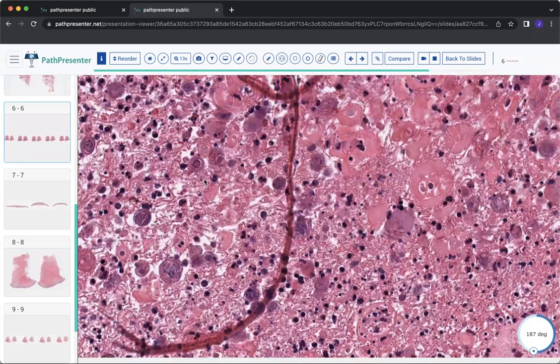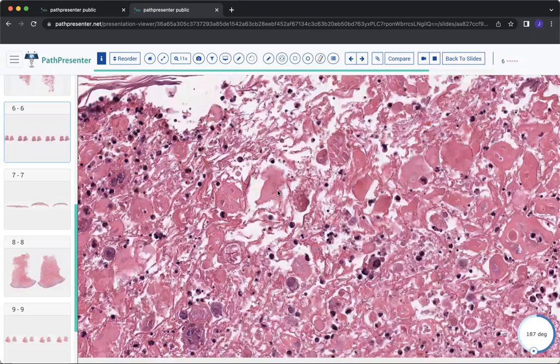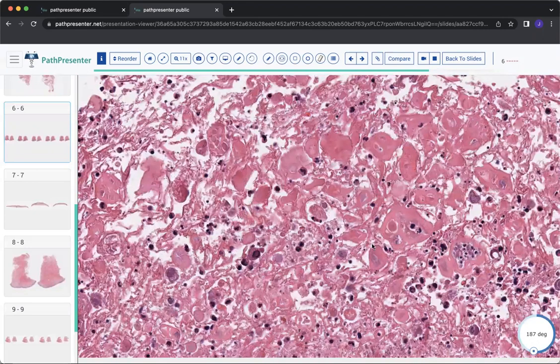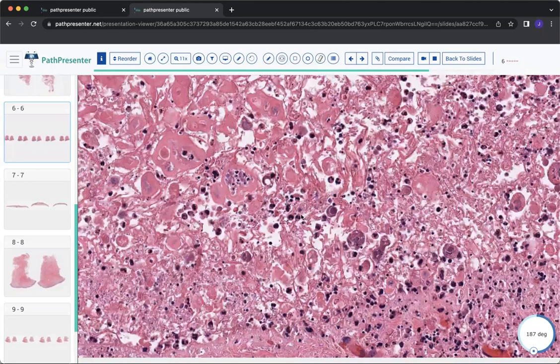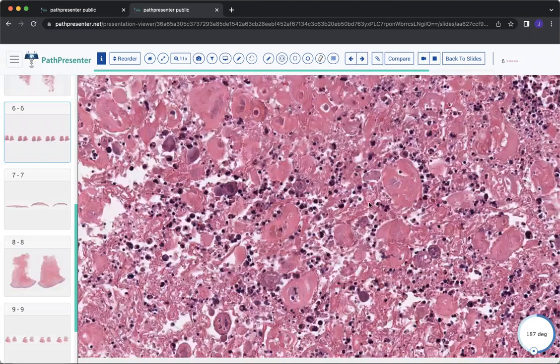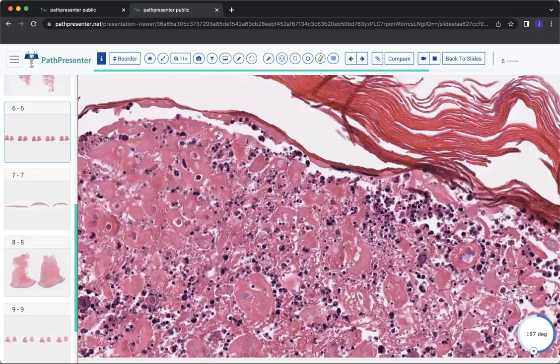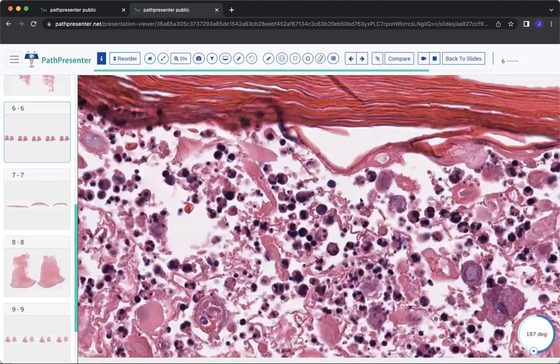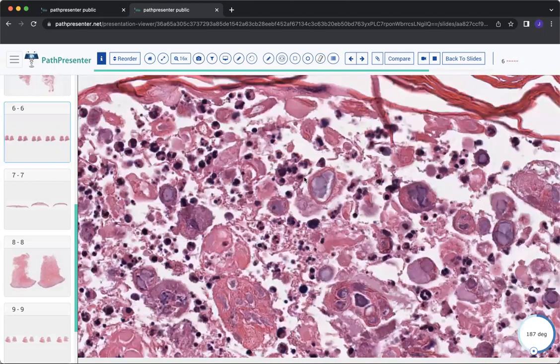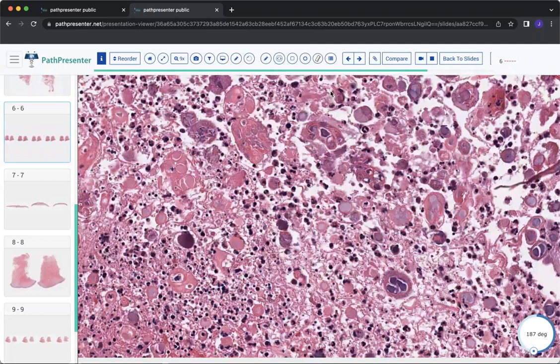And I'm just scrolling around here to actually show you the different stages of epidermal necrosis. Obviously these cells died much longer ago because they're much more eosinophilic in nature, homogeneously. And many of them actually lack nuclei at this point. You can have some overlying neutrophilic inflammation too. It's kind of like forming a little bit of a pustule with the acute inflammation healing program starting to try to recreate the skin barrier again.